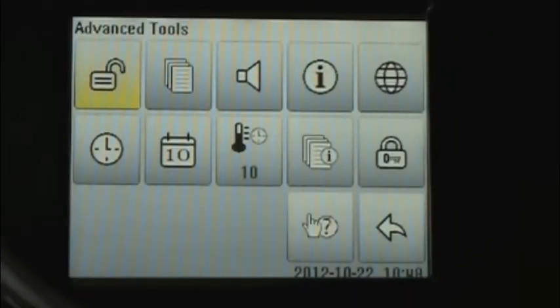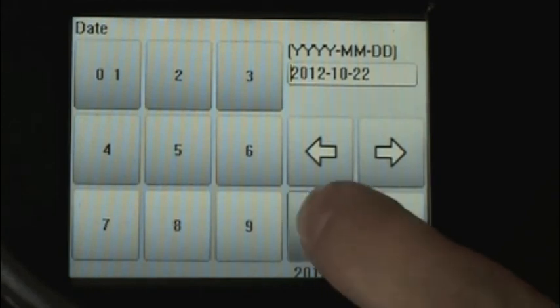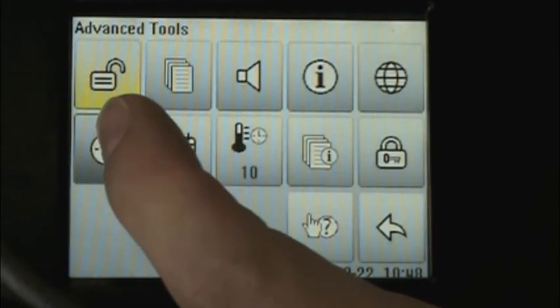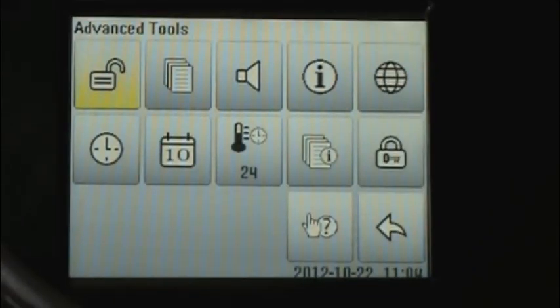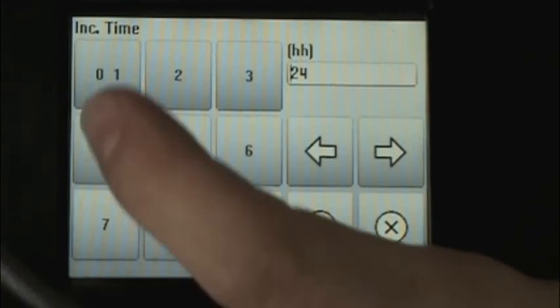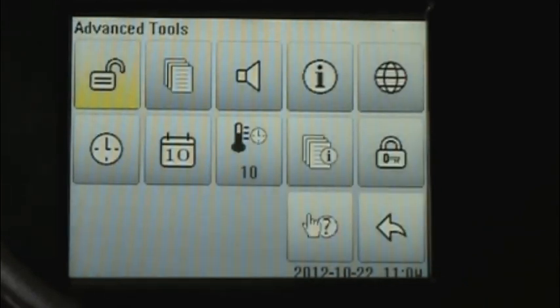From the advanced tools menu, we also need to program the incubator for the correct date and time. The calendar icon allows us to program the appropriate date, and the clock icon allows us to program the appropriate time. When the incubator arrives to you, it will be programmed with a 24-hour incubation time by default. This icon allows us to set the appropriate incubation time. We can also adjust the volume level with the speaker icon.